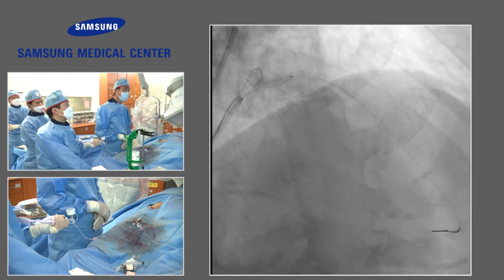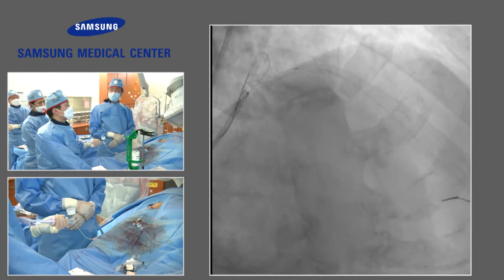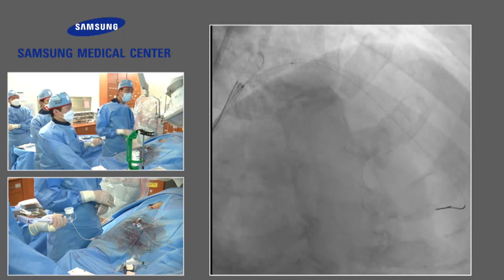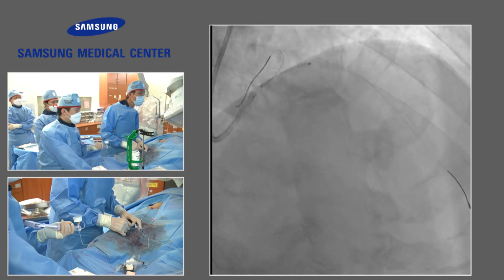If we like the stent well expanded, there is a risk to the side branch. This is a trade-off. So I need to check the IVUS after the main stenting. Definitely, we need to take care of that. Okay, just the stenting test.